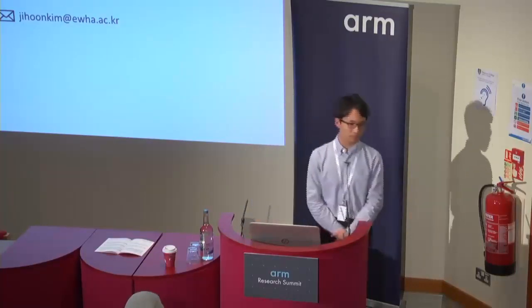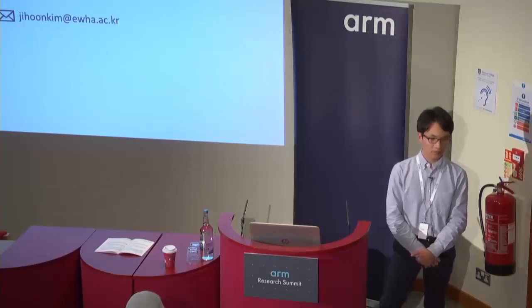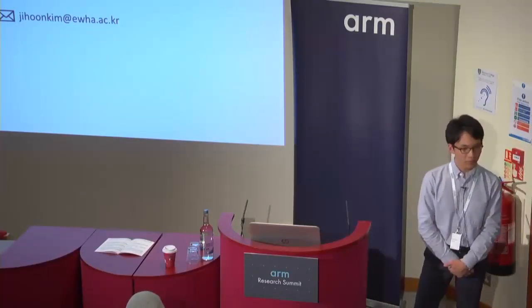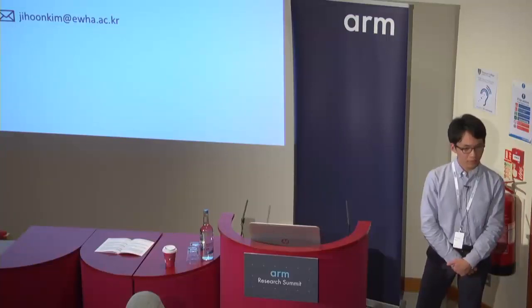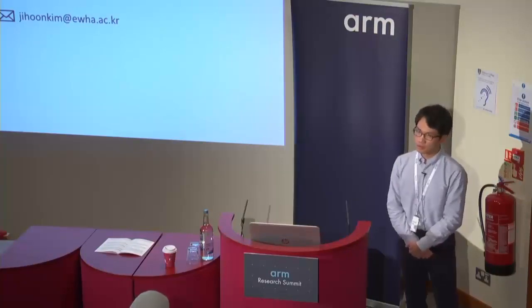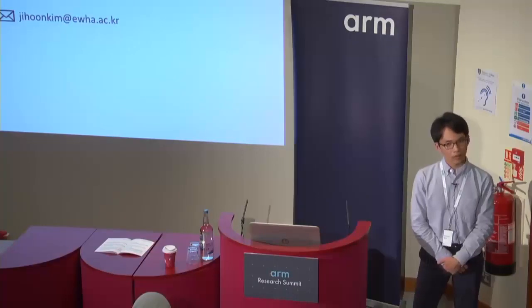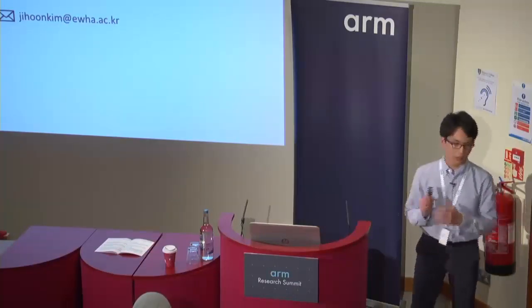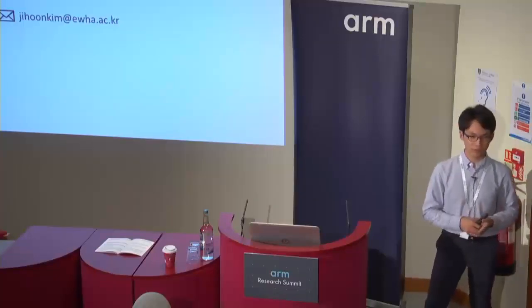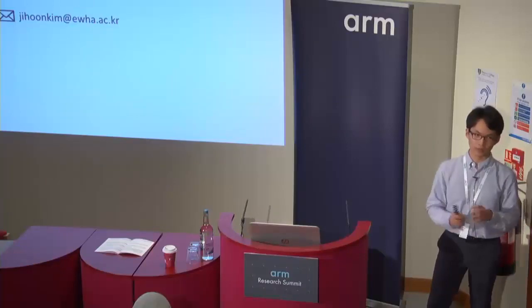So you've been playing with EEG data. How much does the computational burden increase if you have LFP data? Have you guys gotten a handle on that? Pardon me? If you use LFP data, local field potentials, do you know how much the computational burden increases by? So I don't know exactly, but this data can be computed on the Cortex-M3 in real-time processing. So its processing burden is not so significant.